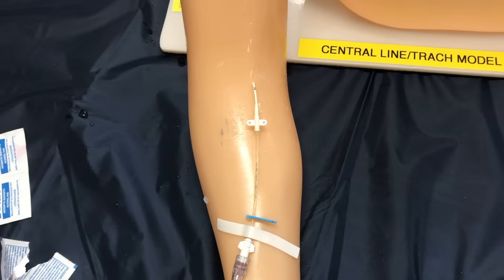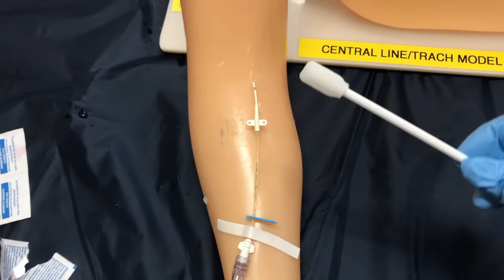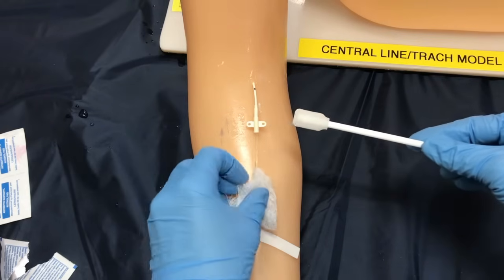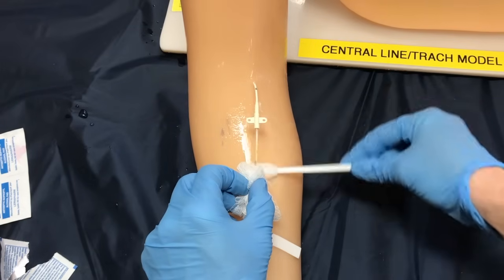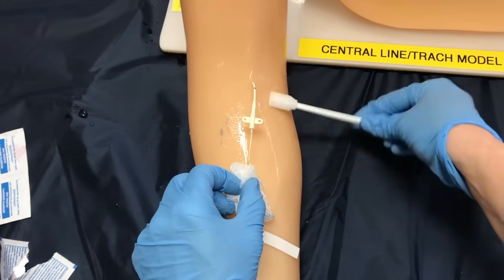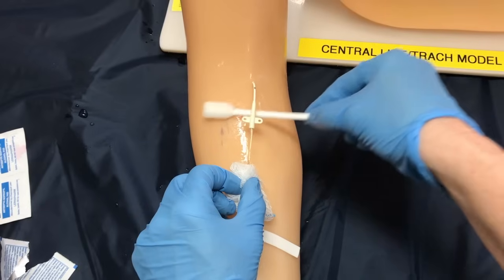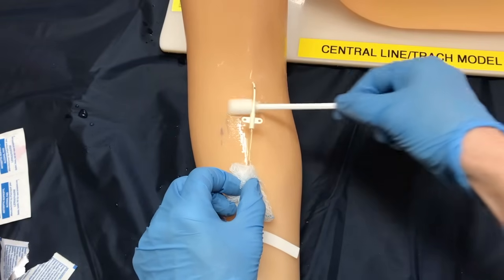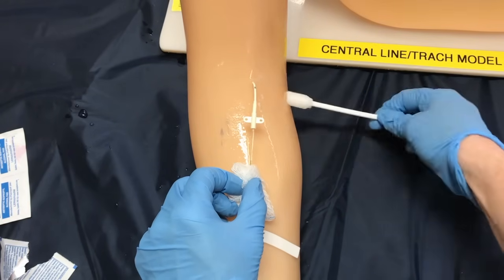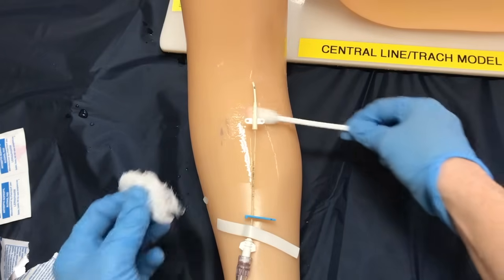This one is done and can be discarded. We're going to grab our second chlorhexidine swab, again making sure we're only touching the handle, and now we're going to do the lower half doing the exact same thing. This may be a place where you want to hold on to your line and lift it up to secure it. We start up and down, big broad strokes, again for fifteen seconds. There's a bit of tape residue here — we're going to flip it over and go in the opposite direction for fifteen seconds.